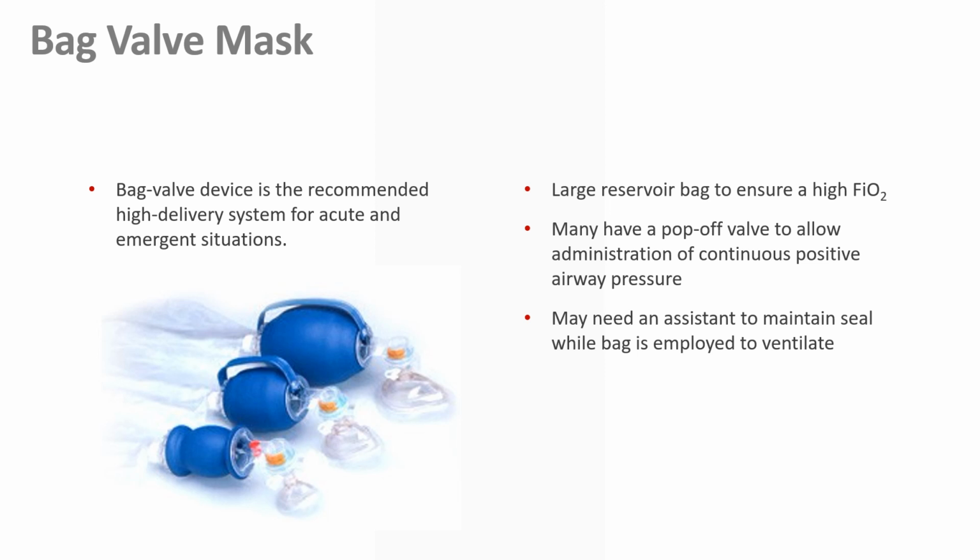And your operating room is like this room. Temperature's up, temperature's down. So every time the temperature changes, what happens to that plastic? Expands, contracts, expands, contracts. Until the next thing you know, you pick it up, and it's not even got the mask on the bag valve. It just falls off.